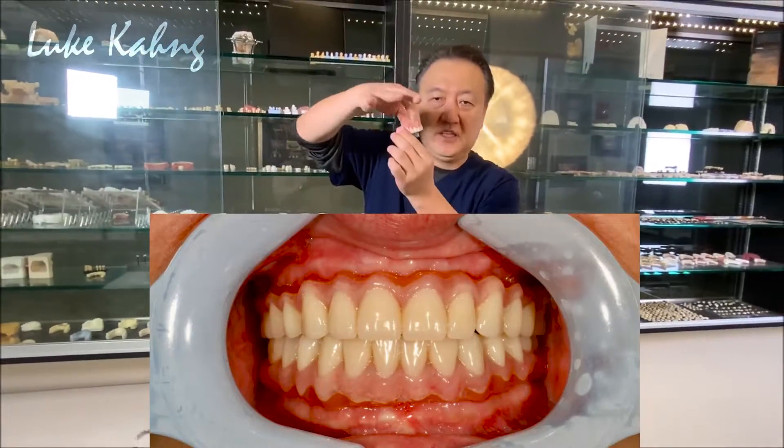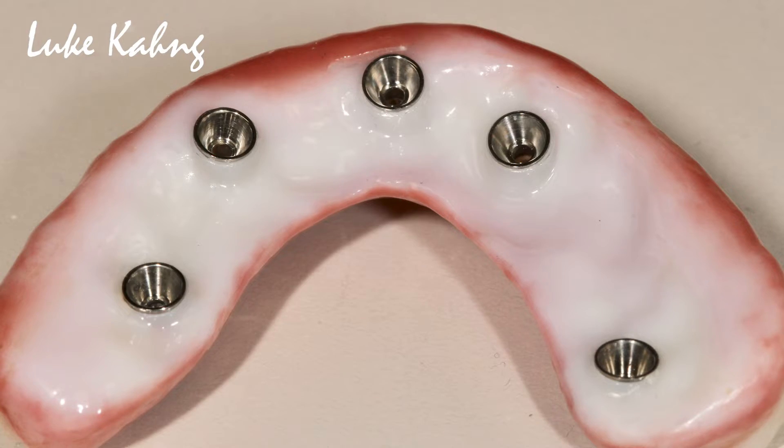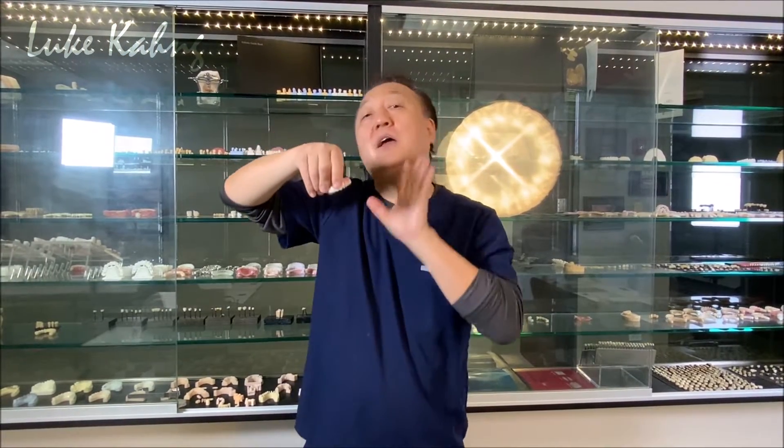Number two: zirconia is usually really thick, but we create problems when making it. Before accepting a case, we block it out. Whether it's a big-mouth patient who needs internal support or a thin-lipped patient where thick restorations feel bulky — patients request thinner from the facial and lingual sides. We have to be careful about the lip line.